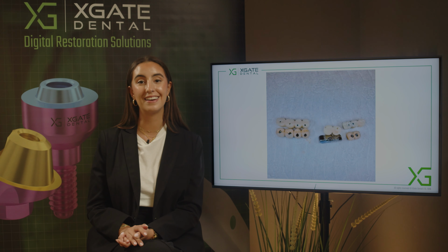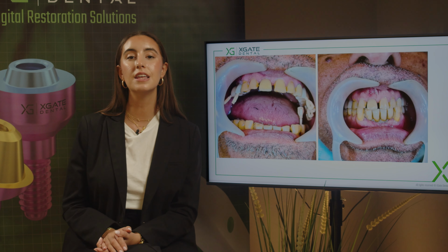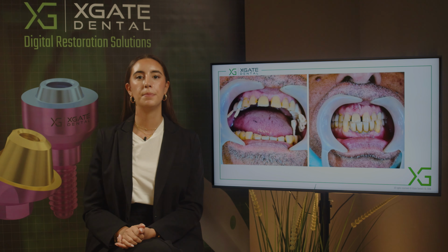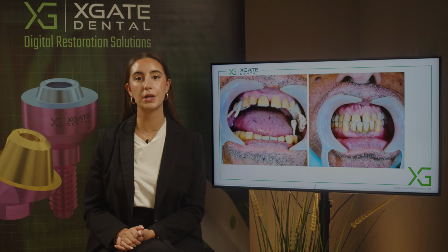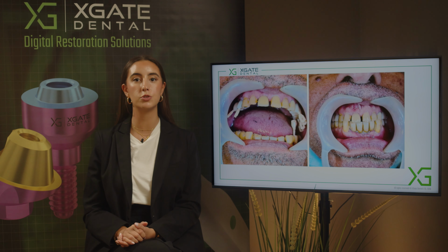We mounted temporary bridges and we wanted to make sure that everything was good. We have one big bridge, one small bridge, and one bridge with a cantilever. We can see that in the occlusion, everything is good. Because we have such proximity between the implants, we did want to leave some space between the crowns so that the patient could clean between the implants so that food won't stick.